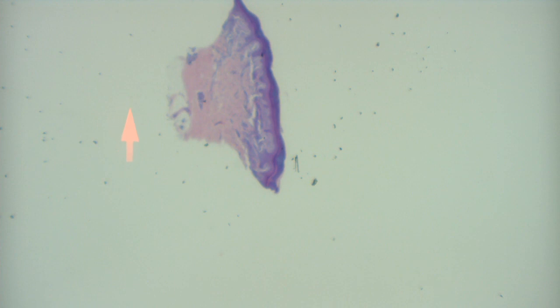And what's the pattern here? A superficial perivascular infiltrate. Can you tell what kind of cells they are? Can you tell what kind of cells they're not? Not lymphs. Good, because they're not dark enough. So something's different. They're mononuclear cells, probably not lymphocytes. That's going to be helpful as we go to higher magnification.